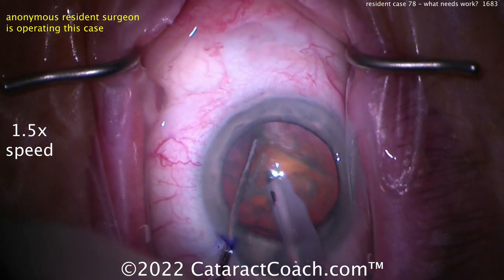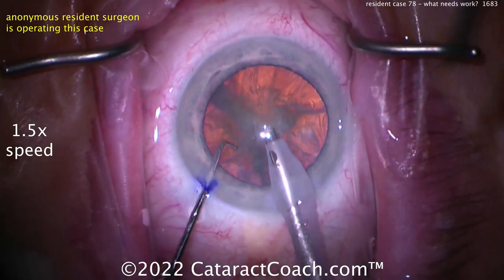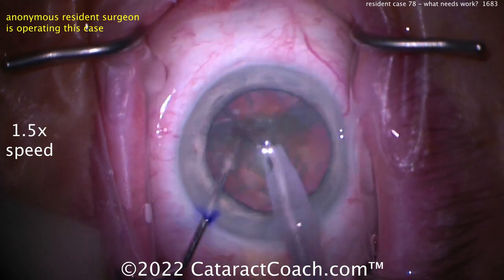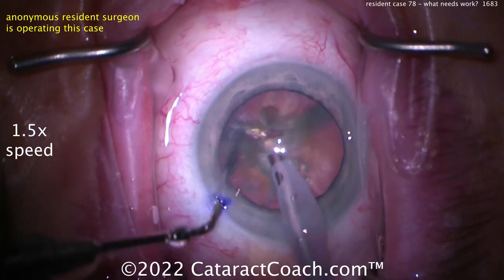Let's see the technique here — oh, horizontal chop at case 78, I like it. The chop went partially through — that's okay. Trying to propagate it, you can do another chop. I like the draping by the way, eye is in good position. Good propagation — got that fully separated.